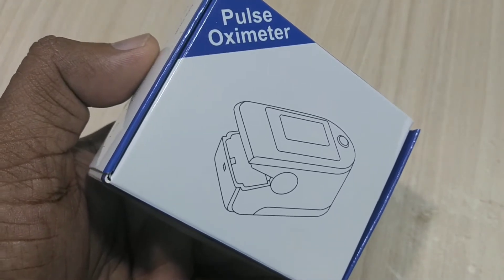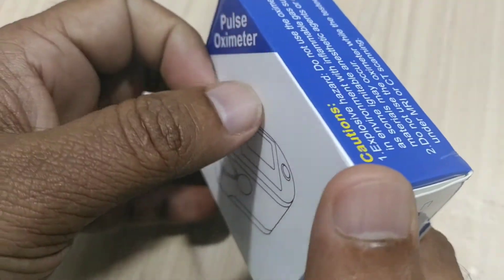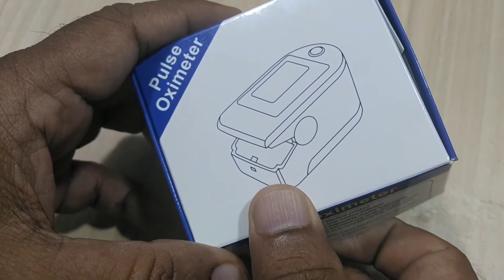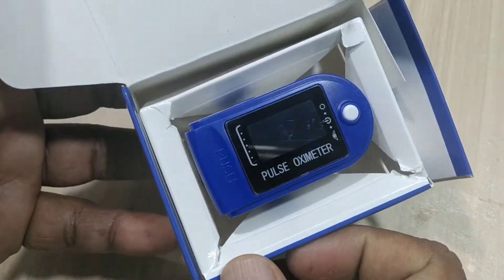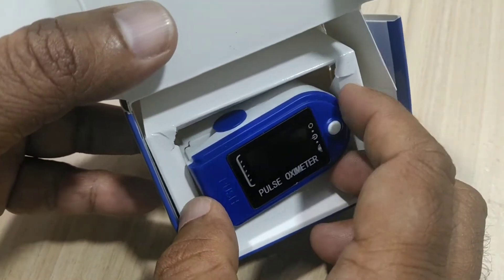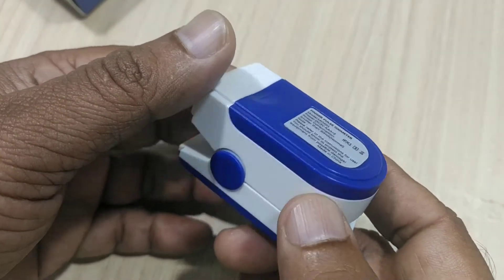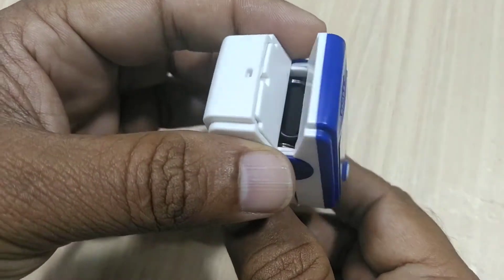Welcome back. Today we are going to tell you about a pulse oximeter. Before that, we'll be unboxing this particular pulse oximeter. The pulse oximeter is inside this small box — it is a small medical device fitted in a small box. Along with this, nothing extra has been given, and this is the device which we can see here.